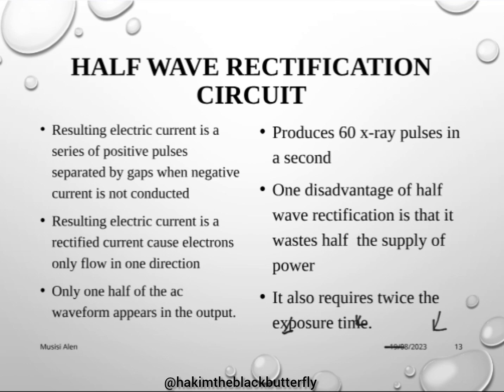So this one will produce about 60 X-ray pulses in a second.